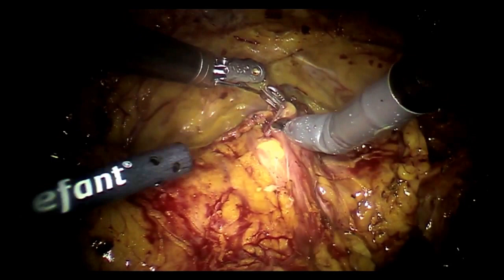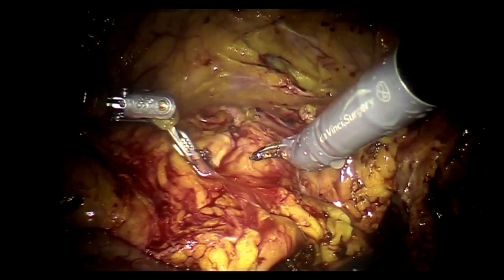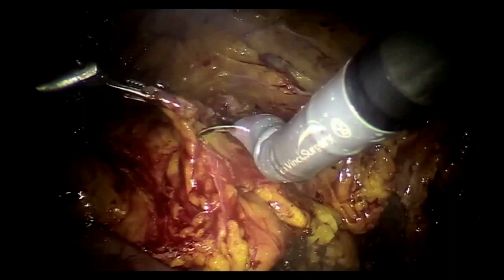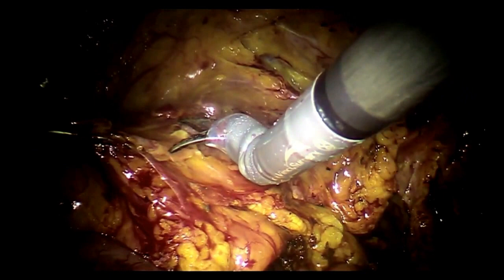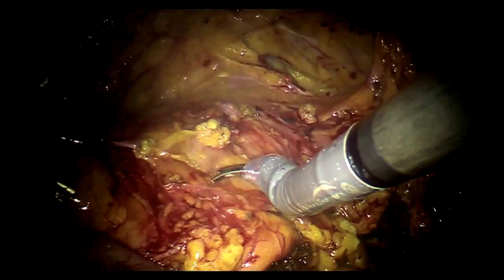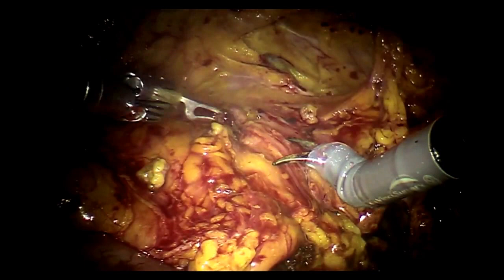Typically we do a nice submucosal dissection to create a trough. That seems unlikely to happen here, given it's such a thin-walled bladder. So we will retain this option. If need be, we can just close it at that point. I'm just defatting it now.